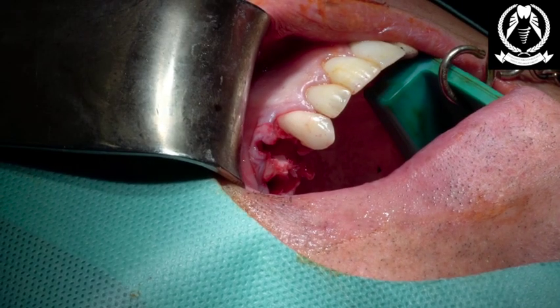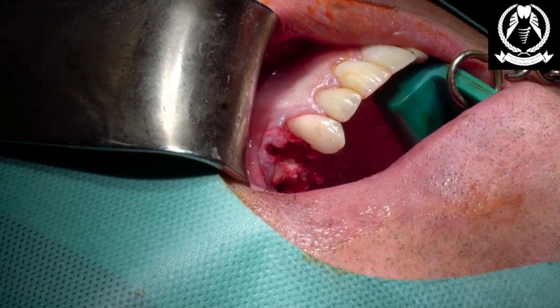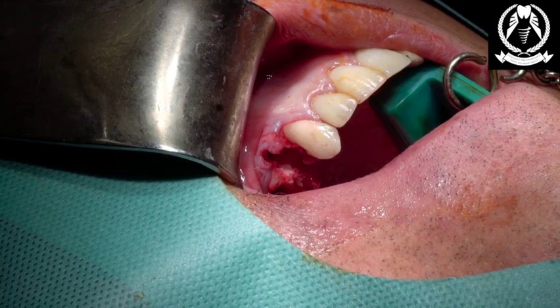Okay, can you set the figures to 70 on the bottom? Yeah, that's fine. 3.5 by 15 millimeter implant.